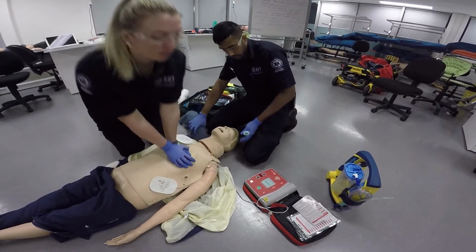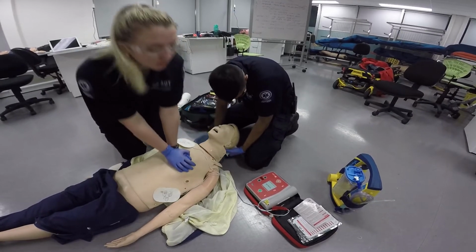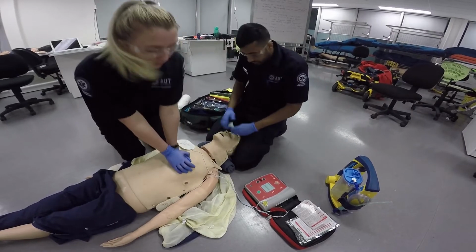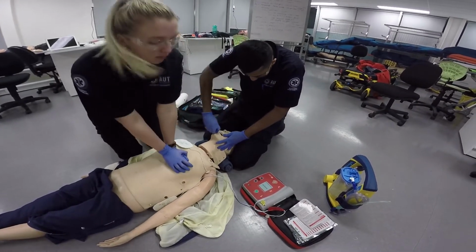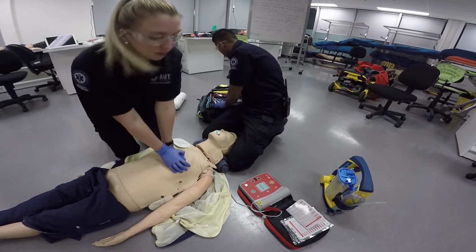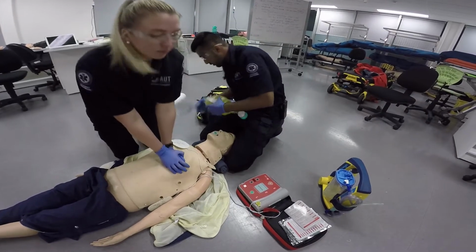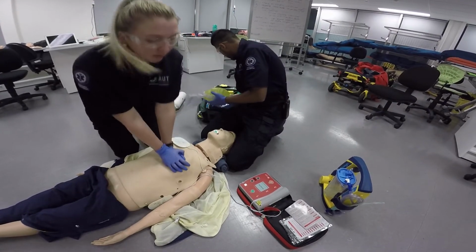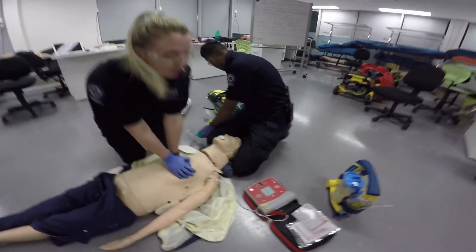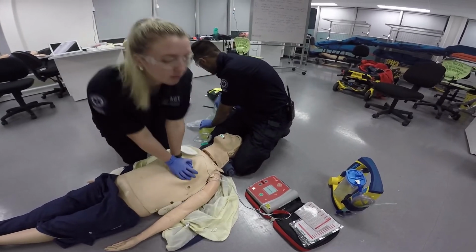I'm just going to place the towel under the patient's head. Alright, and I'm going to insert the OPA towards the roof of his mouth, do a 180-degree turn, just so it sits like that. And I'm going to start ventilating the patient with the bag valve mask and reservoir. Then apply the end of the oxygen tubing to our oxygen cylinder.